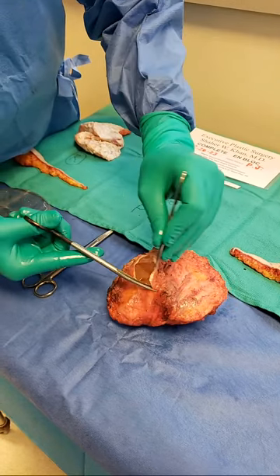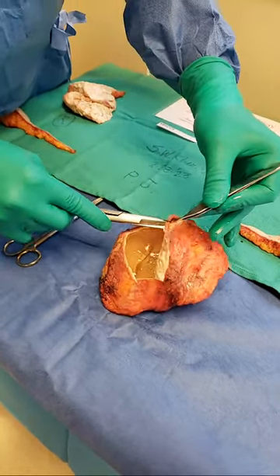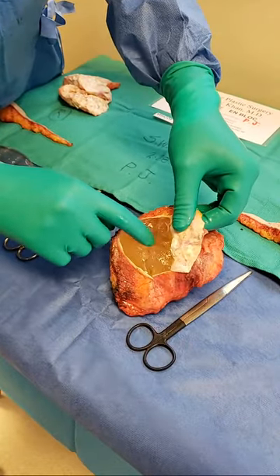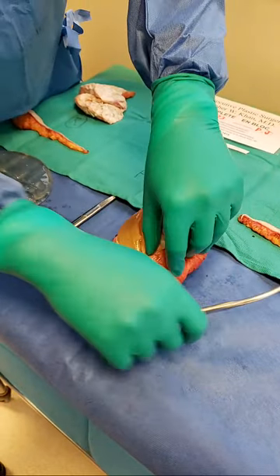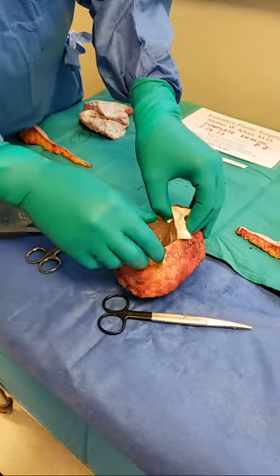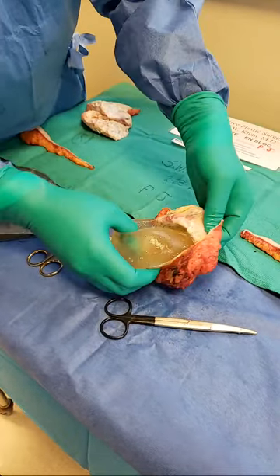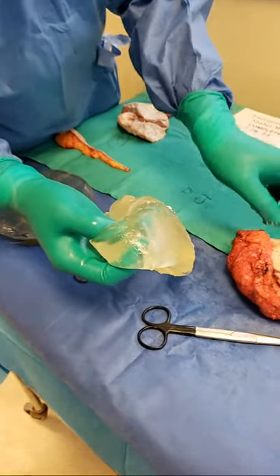Remember, there could be fluid inside — there could be anything inside. You can hear me cut through. Look how the implant is sitting — it's folded up on itself. I could put my finger in. I'm going to open it up a little bit more. Implants are not safe devices. Both saline and silicone are replete with problems. They rupture — they only cause problems. Look at this, the way this is sticking out — this is like a hard shell.